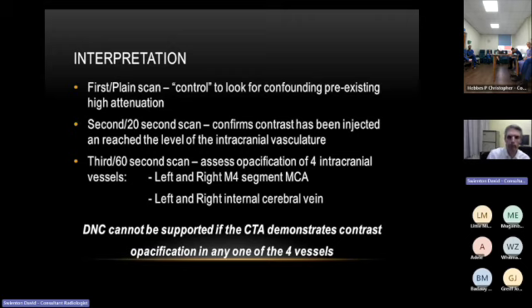I'm going to show you some imaging. When people have very advanced hypoxic ischemic injury, you get all sorts of things in the head that are meant to be there that look incredibly bright. That's simply because they've got very swollen, edematous, dark brain up against them. For a mixture of reasons, some of it is artifact or almost optical illusion, really, that can make normal structures look brighter. You can then discount those later on in the imaging, because effectively what you're looking for is opacification of vessels or high attenuation on the subsequent imaging.